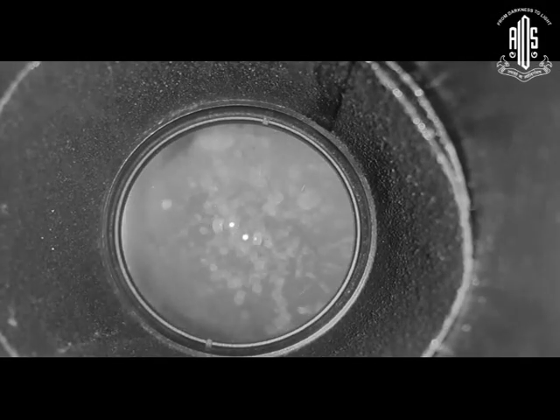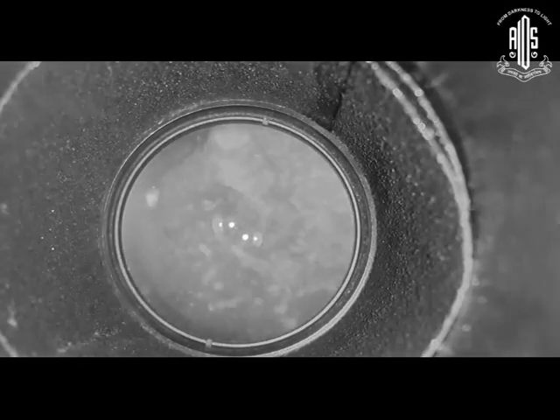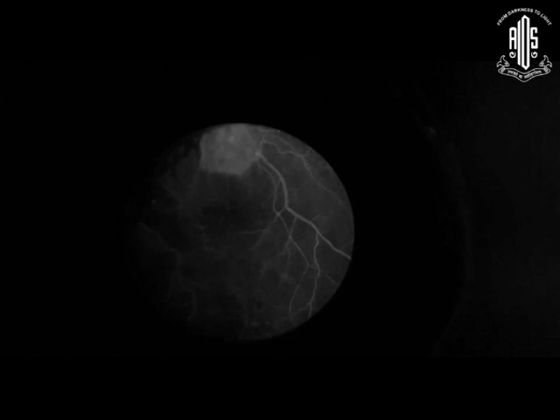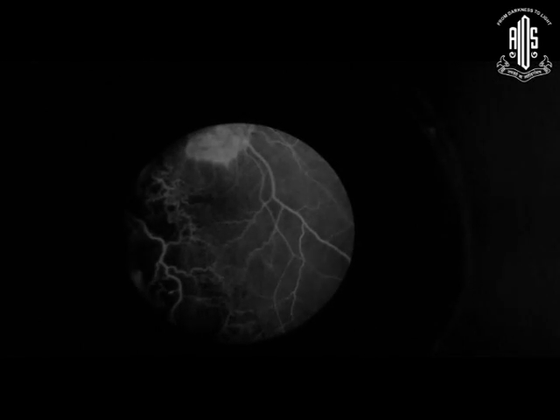And with a simple arrangement, this is the asteroid hyalosis again. It's a dense asteroid hyalosis. The dye is injected and you're waiting. Suddenly you see, we are all tense. At that time you see the dye coming in. You can see the arterial phase, you can see the venous phase filling in, you can see the neovascularization of the disc coming up, you can see the capillary non-perfusion, macular ischemia, and as you wait and see, you see the dye fluorescing more and more in the neovascularization on the disc, and we have the first angioscopy.